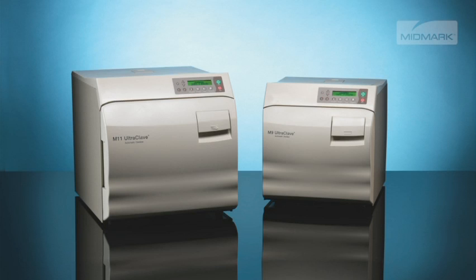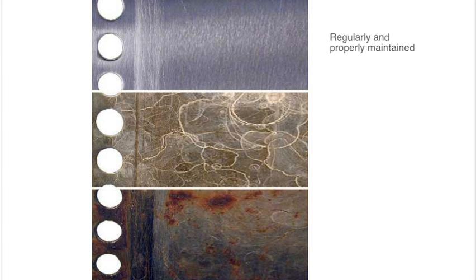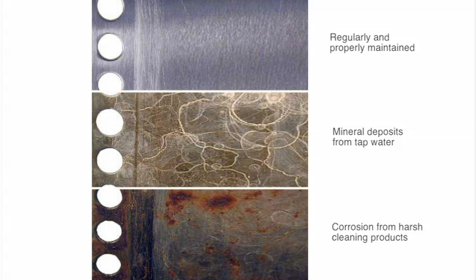Your Midmark autoclave will provide many years of trouble-free service if recommendations for periodic maintenance are carefully followed. Recommended maintenance is easy to do and takes very little time. If the recommended maintenance is not performed, mineral deposits and corrosion can build up on the internal components, resulting in operational problems, downtime and service fees.